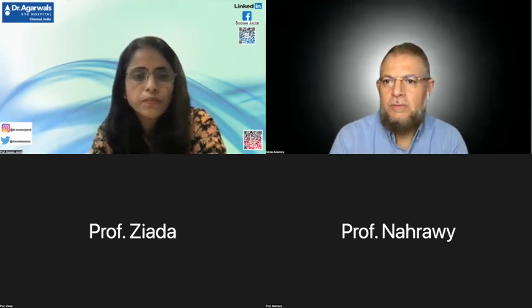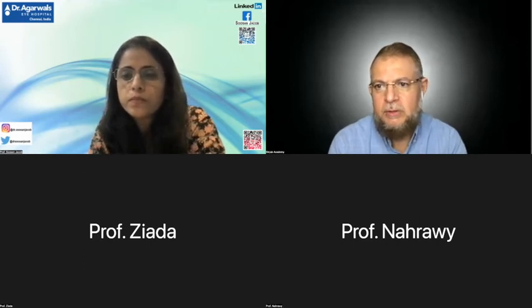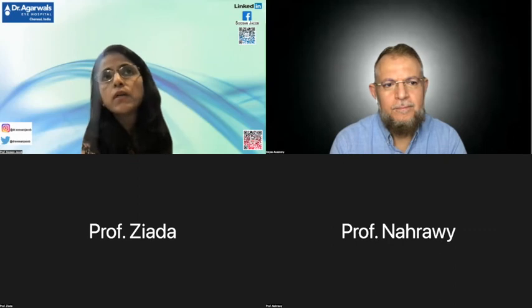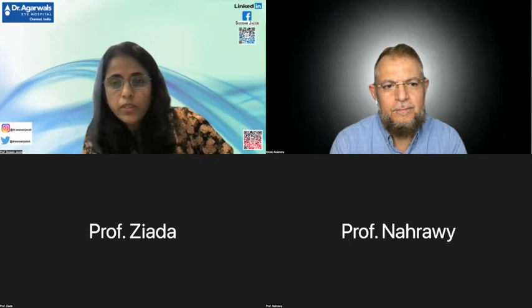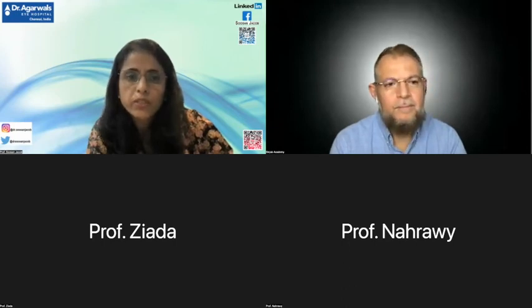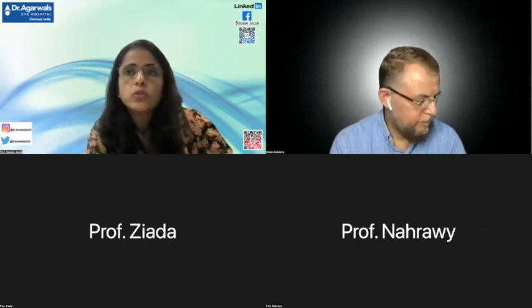Great. A question from one of the audience: what other refractive procedures can we do in patients with CAIRS? Yeah, that's a great question. In Canada, Greg Maloney and some other very senior doctors like Dr. Alan Slomovich are also going to start CAIRS, and Greg especially has been considering combining topo-guided PRK with CAIRS. So is Tanya Trin from Australia, who's also going to start topo-guided PRK with CAIRS. I think Shady Awad is already doing that. So you can combine all of that.